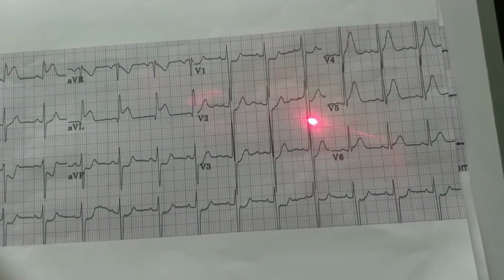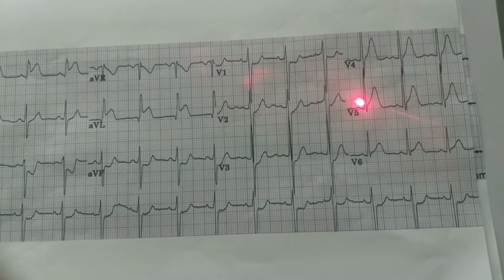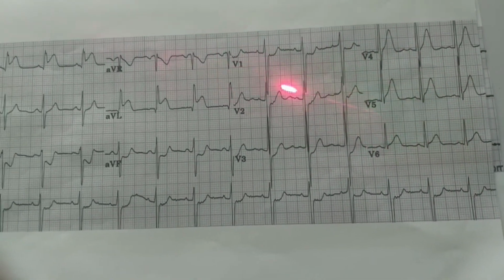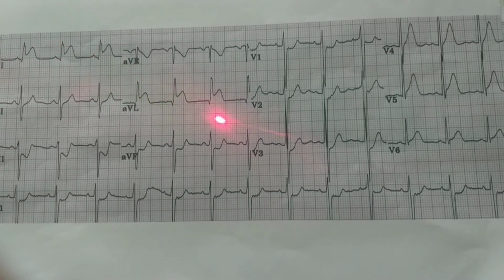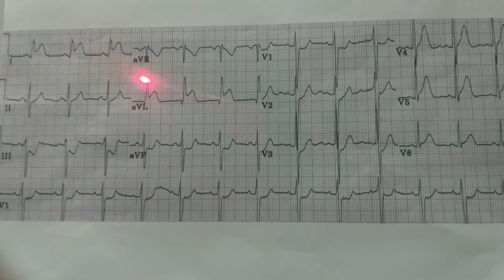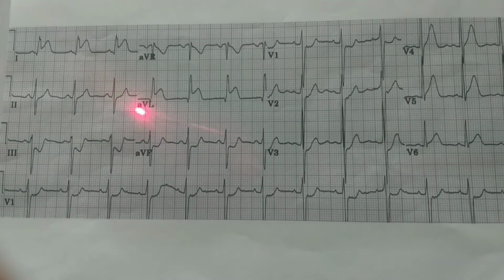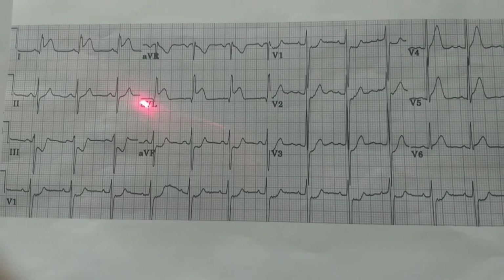Now looking at V1, V2, V3, V4, V5, V6, other than this ST going high, there is no specific change. So this is lateral wall ischemia, lateral wall ST elevation MI, and probably the culprit artery may be the left circumflex artery, but this would be diagnosed properly on angiography, which one is the culprit coronary artery.